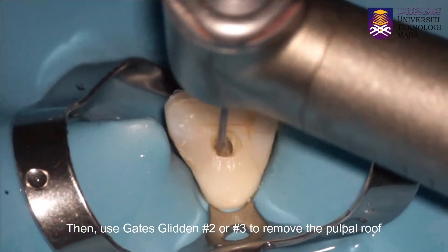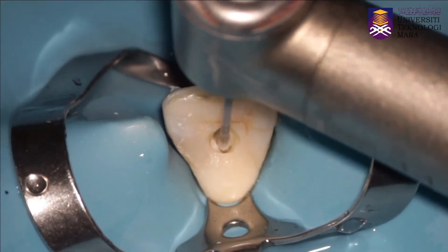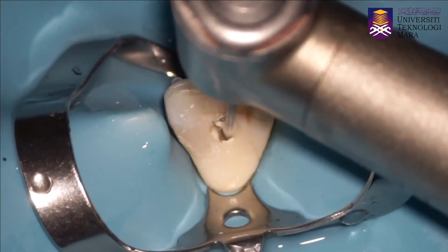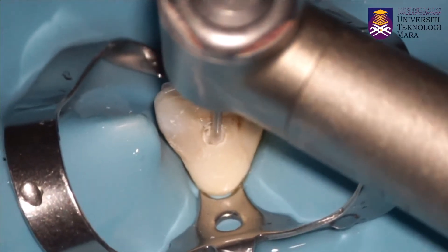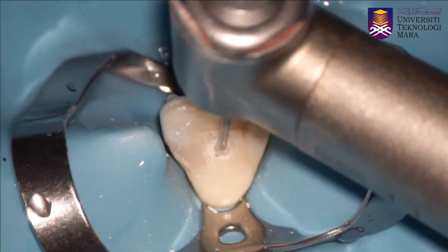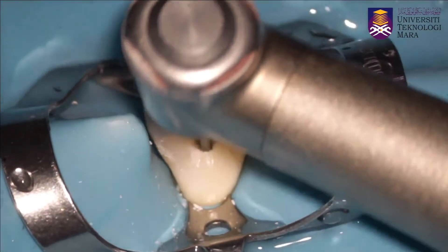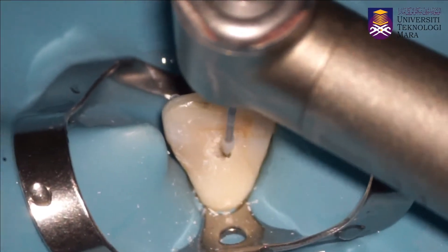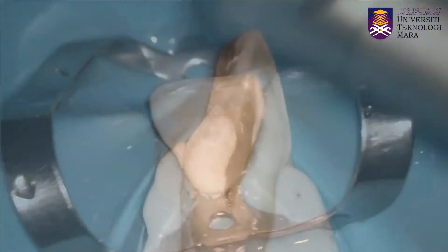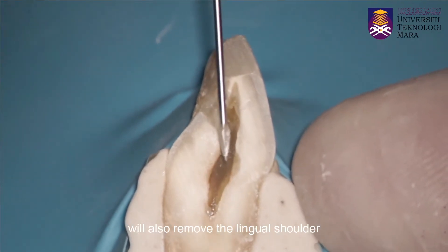Then use Gates Glidden size 2 or 3 to remove the pulp roof. In the sectional view, we can clearly see that the Gates Glidden will also remove the lingual shoulder.